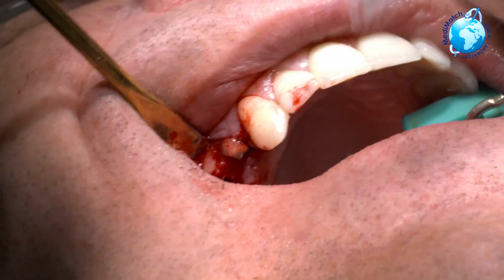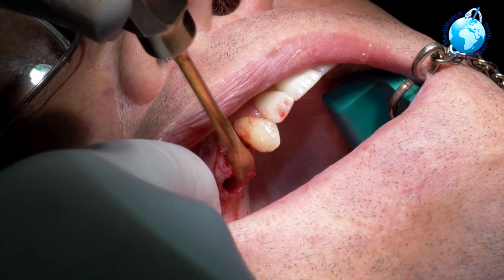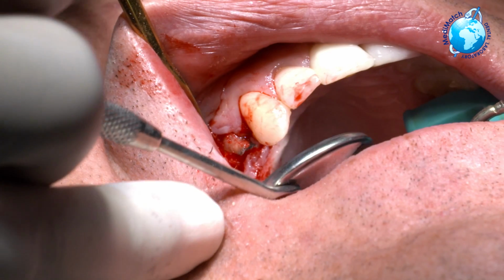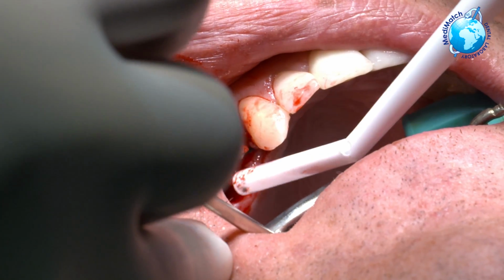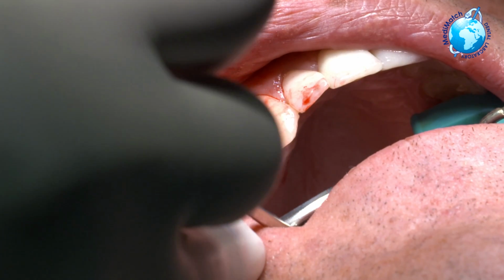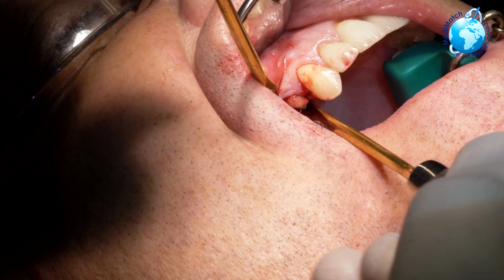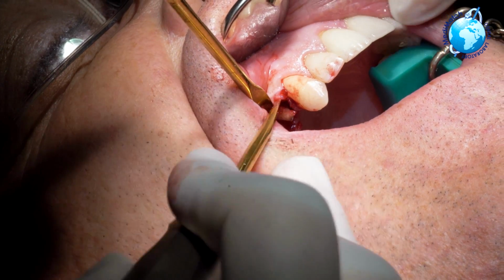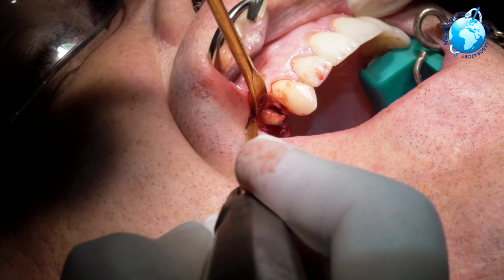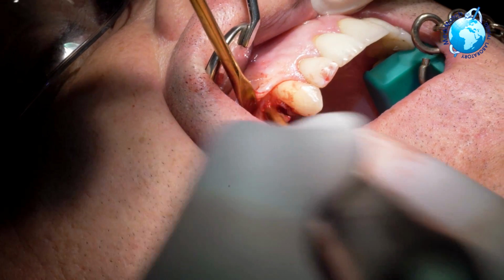Okay, have a mirror. Sometimes we divide roots up and we'll see what we've got left. I'm going to reflect a little bit on the palatal, Bianca. So I'll just reflect with the other luxator there, see if this wants to play. Let's take that papillae there as well to see. I'm just gently elevating the flap, see if we've got any more movement.